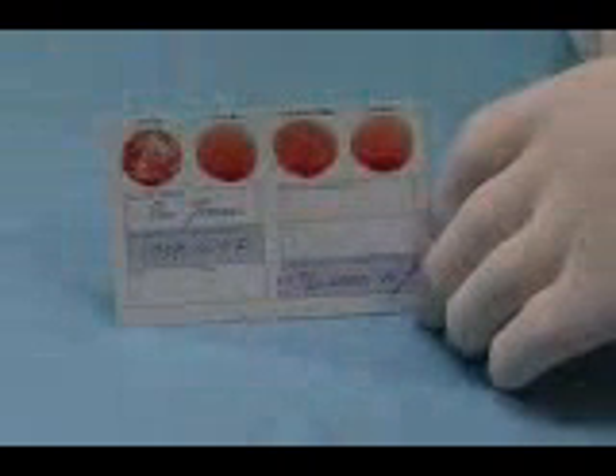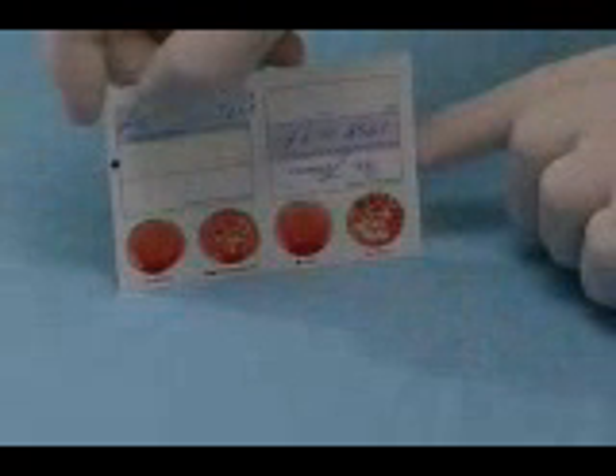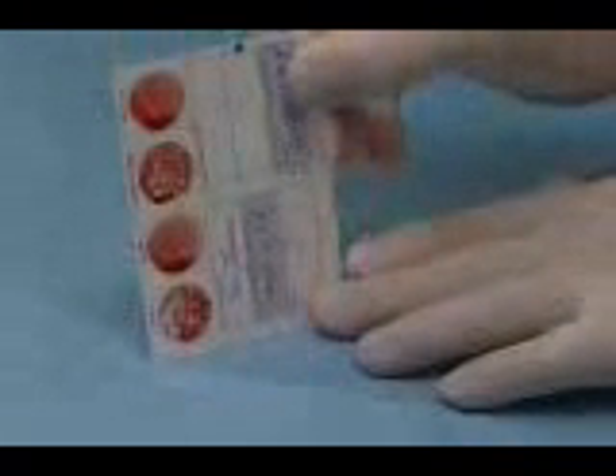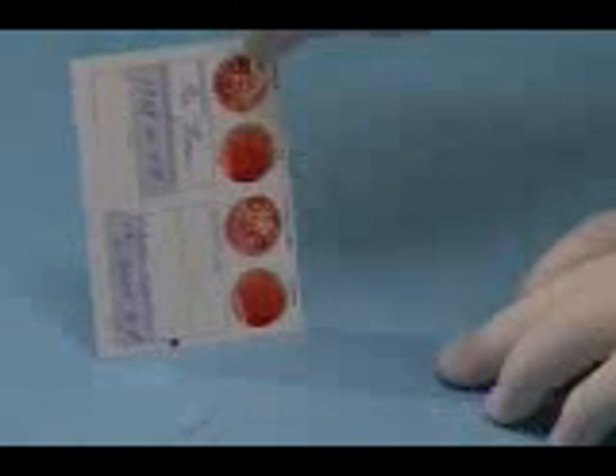Now tilt the Eldon card into a vertical position and wait 10 seconds. Then turn it upside down and wait another 10 seconds. Tilt the card to one side and wait 10 seconds. Then, finally, tilt the card in the opposite direction and wait another 10 seconds.